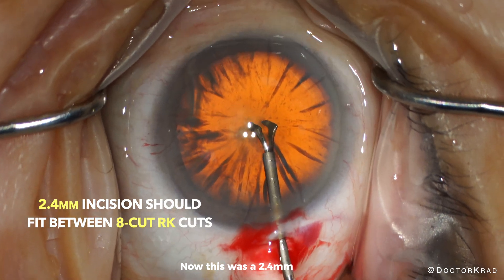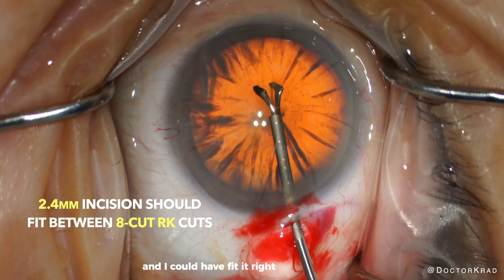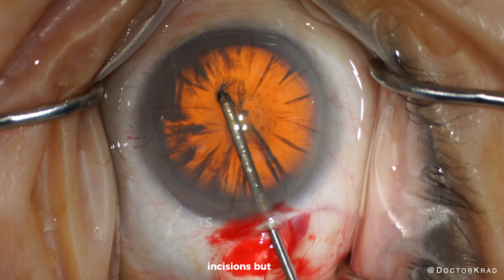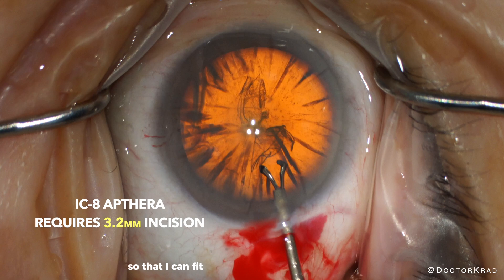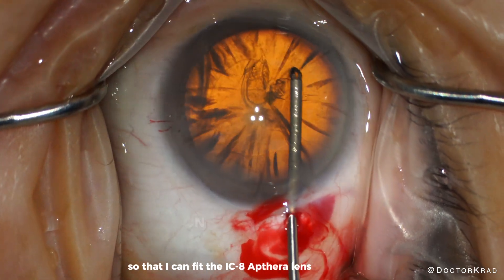This was a 2.4 millimeter blade and I could have fit it right between two RK incisions, but later I'm going to expand my incision to 3.2 millimeters so that I can fit the IC8 Apthera lens into the eye. You need to have this gap between the entry of the scleral incision and the RK incisions so that your incision doesn't radialize into the RK cuts.